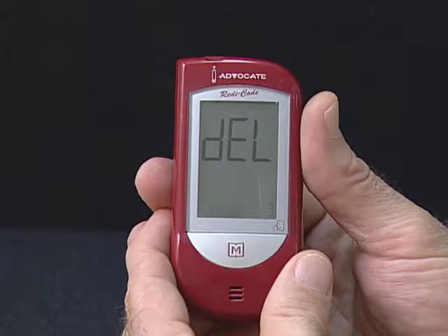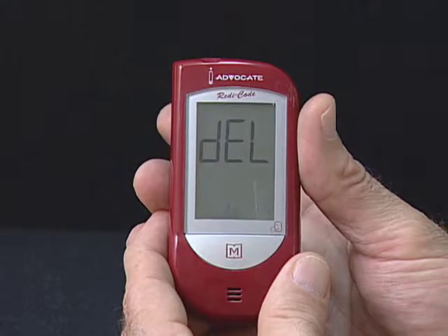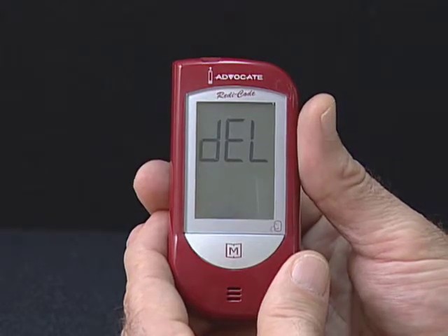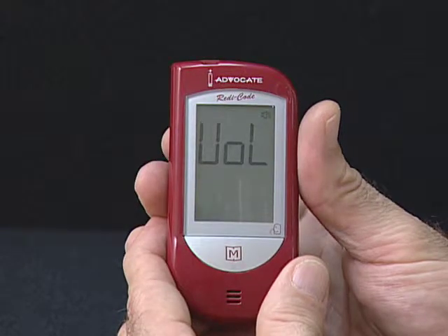Step 8: When DEL and blinking M symbol is displayed, if you do not want to delete the memory, press the Set button again to skip this step.